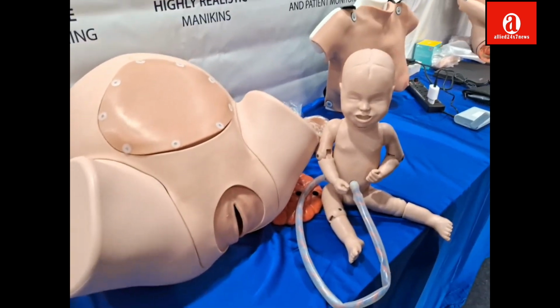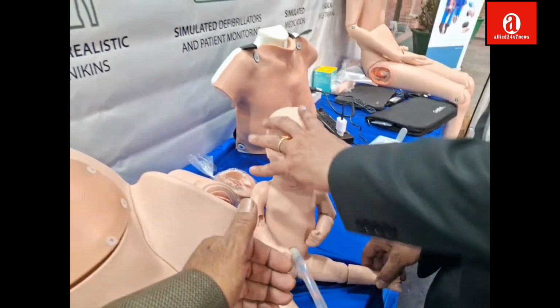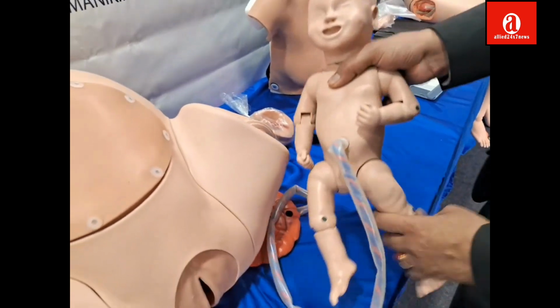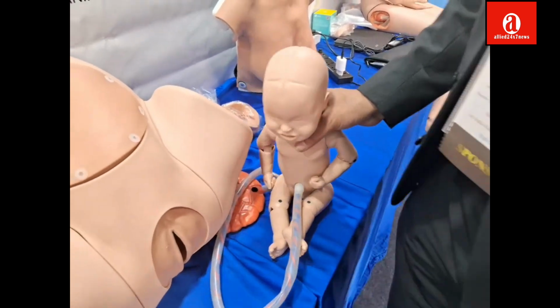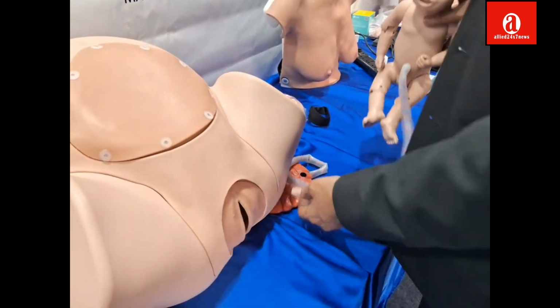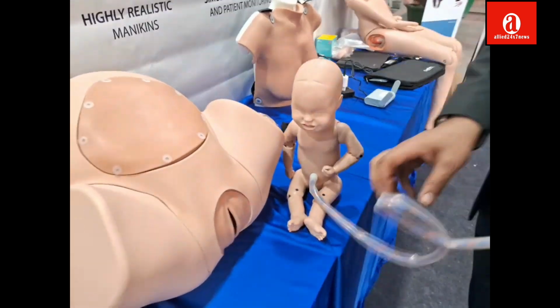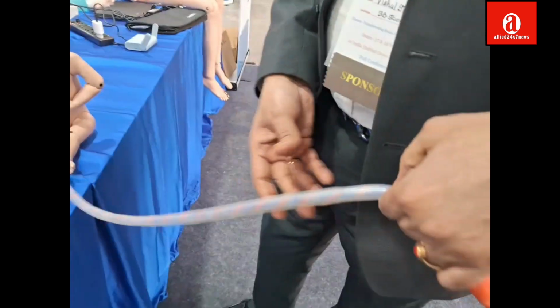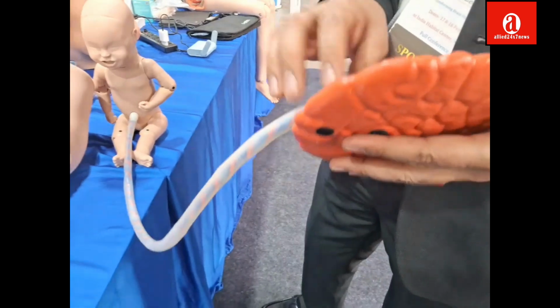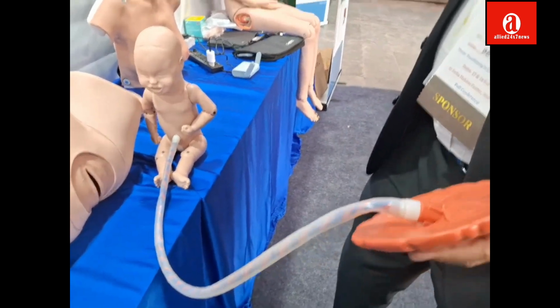And this child is also the same in terms of weight or size? Yes, in size. I would say weight is approximate, but yes, then it has its umbilicus. How long is the umbilical cord? It's about a meter. It depends on the size. I don't know, I've never experienced it.